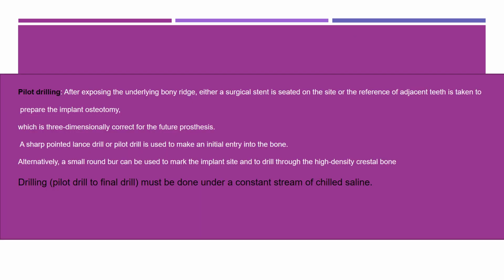And coming to the next, there is pilot drilling. So there is the initial drill. So it can be called as lance drill or locator drill or anything. Okay, so it will be just 2 mm wide, and so that will be drilling to the depth. So there is the initial drill, initial point it will be.